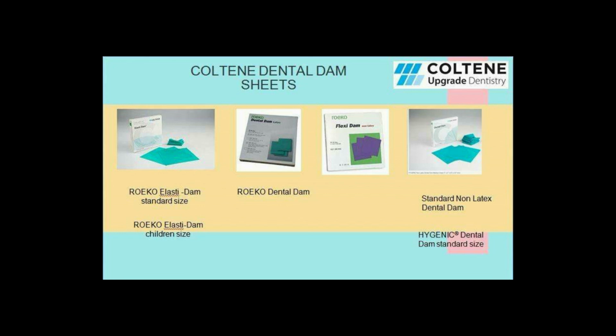The next one is the Roeko FlexiDam sheet. The difference between FlexiDam and ElastiDam is that FlexiDam is non-latex material, so it is very good for people with latex allergy. The last one is the standard dental dam sheets, which are made available by Hygienic. They are available both as latex and non-latex, and they are available in standard and children's size too.